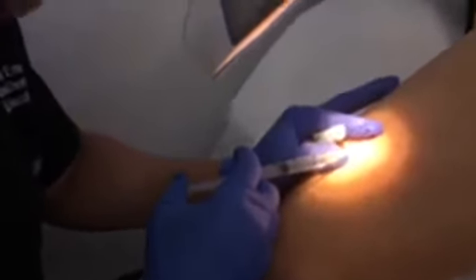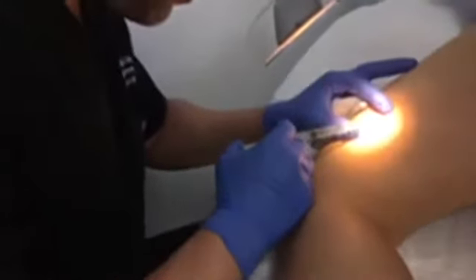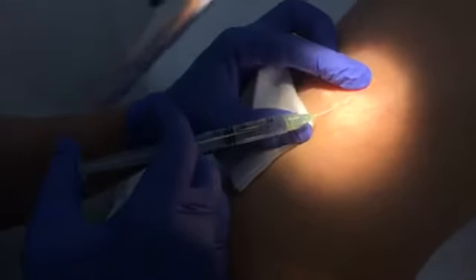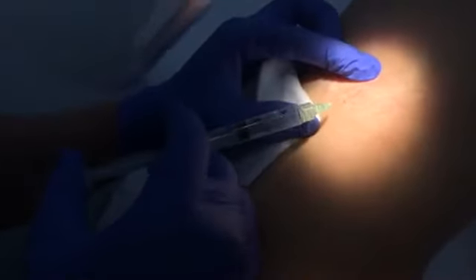And the issue is with veins, they have a tendency to want to come back frequently. And some of them, like that one, are a little stubborn with their valves. So there we go, another one right there, a nice little branch. And you can see it spreading throughout that branch to all the areas of those veins. What happens is the veins then get irritated, they spasm, and long term they then disappear. Often a series of treatments are needed to get the best outcome.